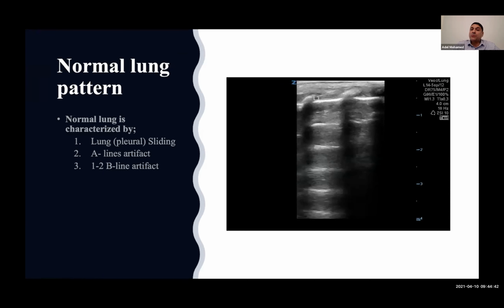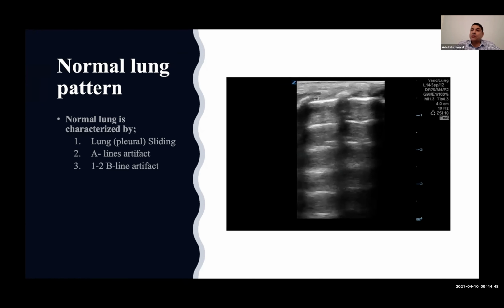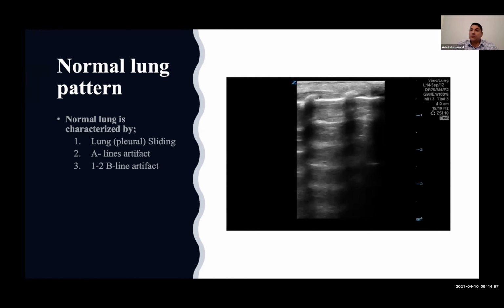Ultrasound should be incorporated in your overall assessment of your patient. You don't treat the lung ultrasound, you treat your patient. Focus on the patient overall, what's going on. Then use the lung ultrasound as a tool to help you narrow your differential for your patient. Same for preterm babies, expect to see B lines, because this is part of their immaturity, and an immature lung does not mean that there is something not going well with this patient.